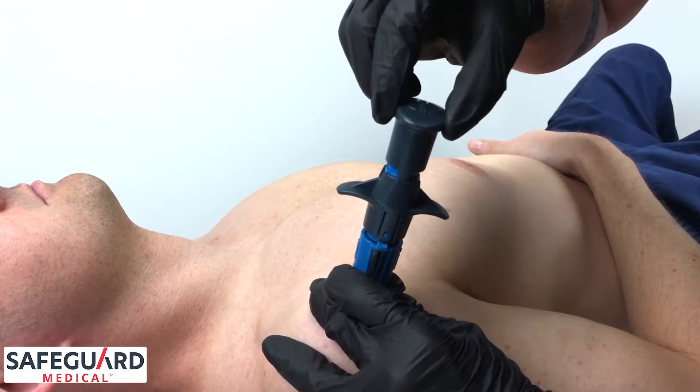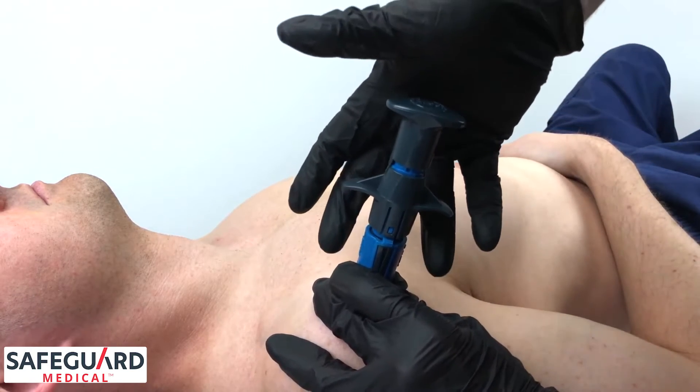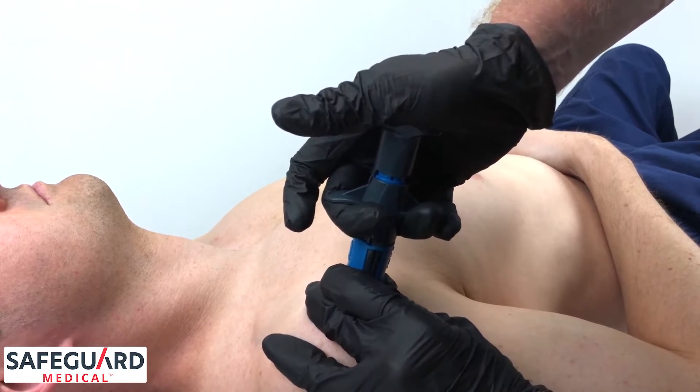Now rotate the safety cap 90 degrees. Utilizing the palm of that hand, fully compress the neo, then pull up on the trigger wings, deploying the neo.